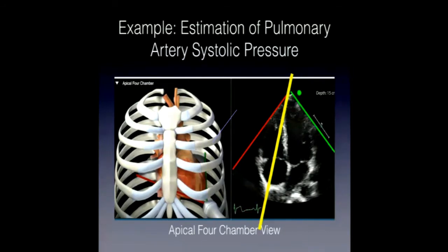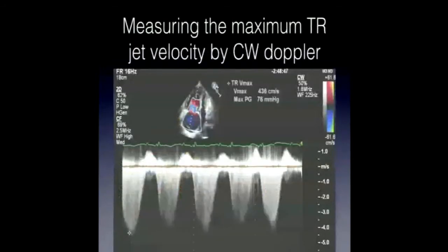But sometimes for the tricuspid, I'm quite off. So this is actually pretty good. We're lined up. I didn't show the jet here, and this is kind of similar. They've made it more rightward, and then the jets. And then again, 4 meters per second.